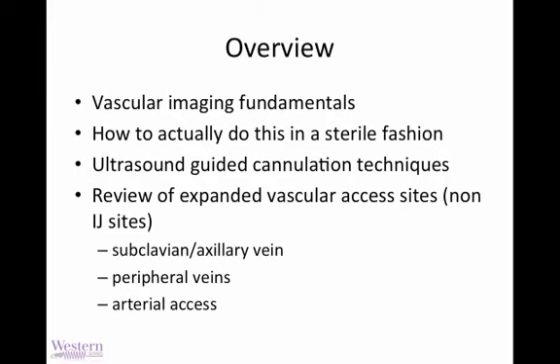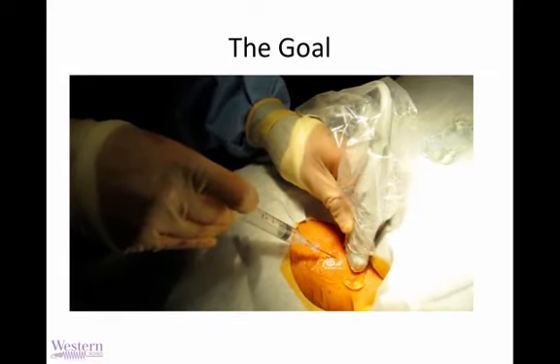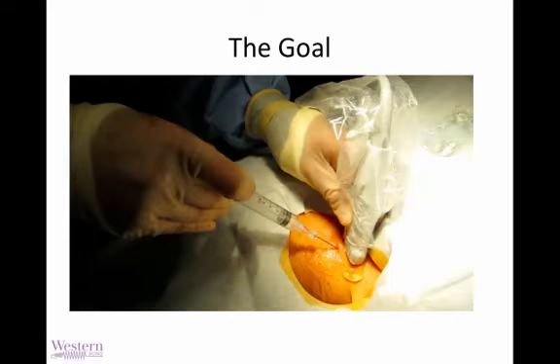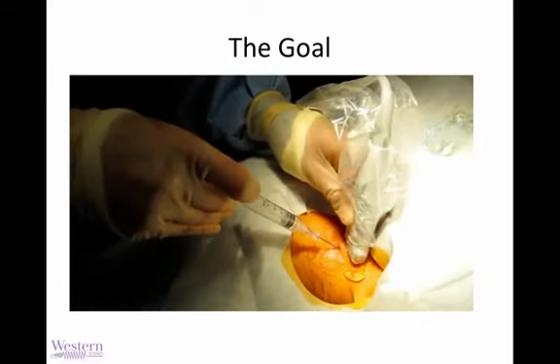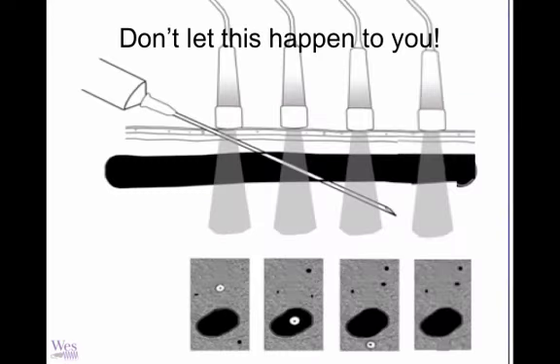I'd like to acknowledge many of the great audiovisual materials in this presentation come from Dr. Arun Nagdev, who is featured here, and he is the Director of Emergency Ultrasound in Oakland, and an excellent ally and an excellent educator. So thank you, Arun. Of course, the goal will look something like this at the end: calm, poised, ultrasound guided, sterile, rapid. All those things will be actualized after you sink your teeth into this material and get some hands-on practice.